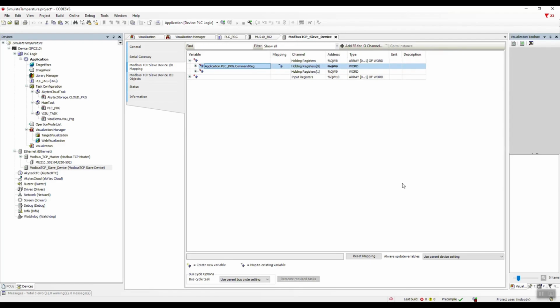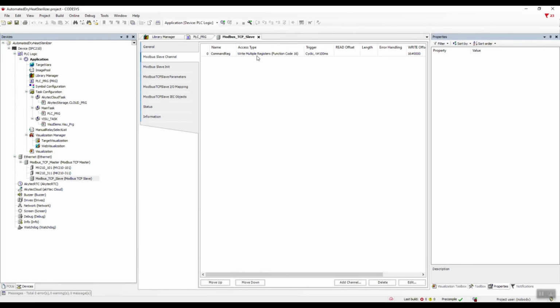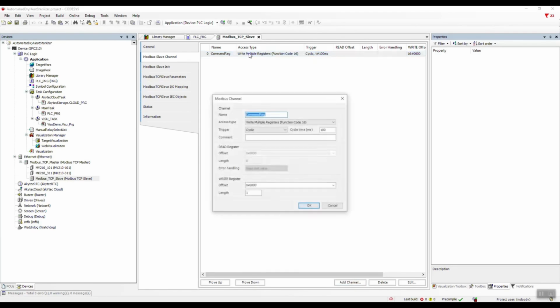Now let's go back to our main sterilizer project and add a standard Modbus TCP slave device from CODESYS to the Modbus TCP master device. In the Modbus Channel Slave tab, add a channel to send the command to the emulator. I already have this channel added. In the Name field, enter the name of the emulator command variable. In the Access Type field, select the Write Multiple Registers function, or function code 16, and in the Offset field, specify register 0.